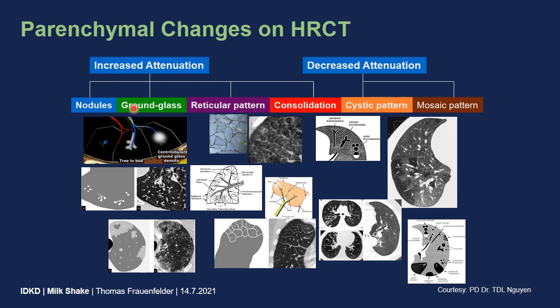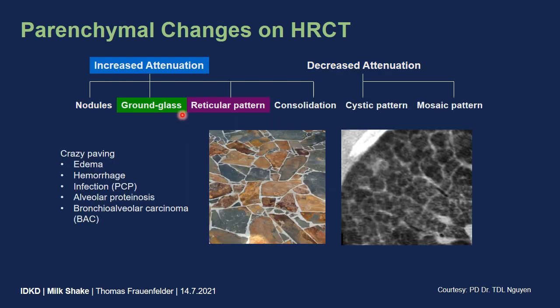In our case we have a combination of the ground glass and reticular pattern. This leads to the so-called crazy paving, which appears in edema, hemorrhage, infectious, alveolar proteinosis, and bronchoalveolar carcinoma.